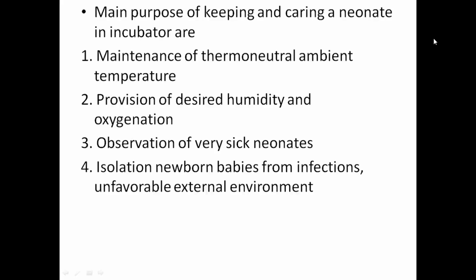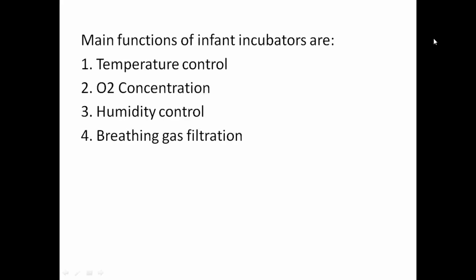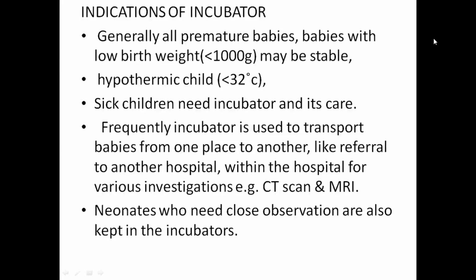Main purposes of a neonate incubator are: first, to maintain the thermoneutral ambient temperature, provision of desired humidity and oxygenation, observation of very sick neonates, and isolation of newborn babies from infection and unfavorable external environment. Main functions of incubators are temperature control, oxygen concentration, humidity control and breathing gas filtration.